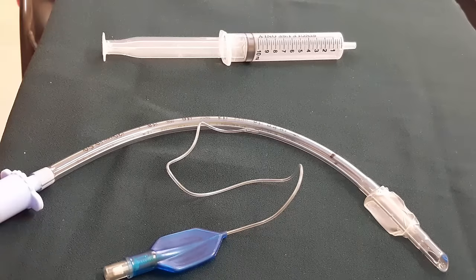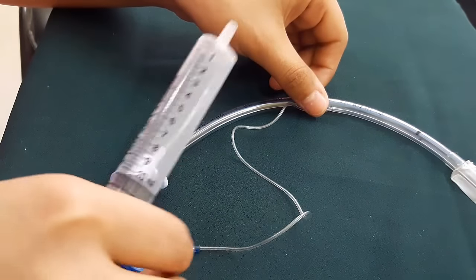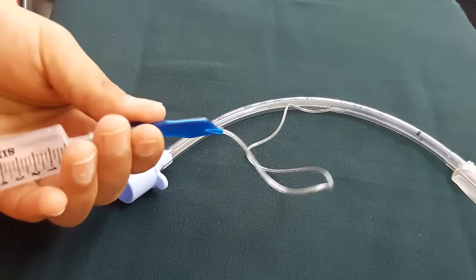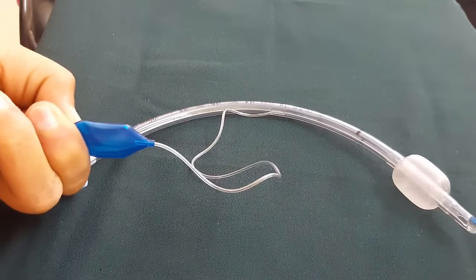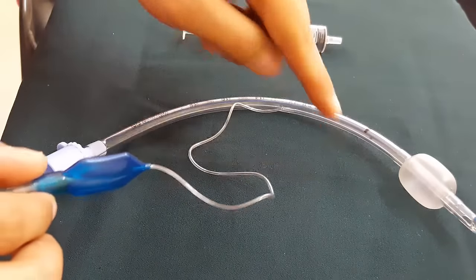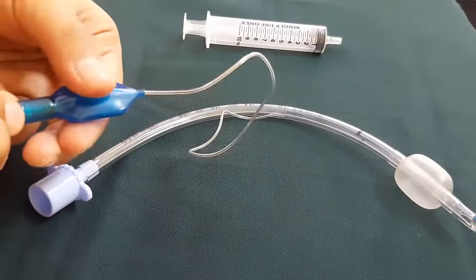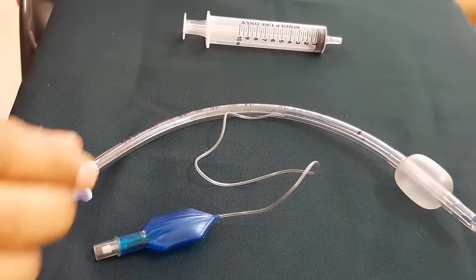Regarding inflation of the cuff, we use a syringe. There is a small tube that runs alongside the ET tube, and at its proximal end there is a pilot balloon. This pilot balloon has a one-way valve. When we press the syringe, the cuff gets inflated. Because of this one-way valve, we can check the cuff pressure and it remains inflated. If the cuff is leaking, we can detect it as the pilot balloon will collapse.